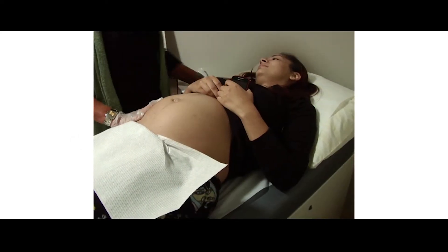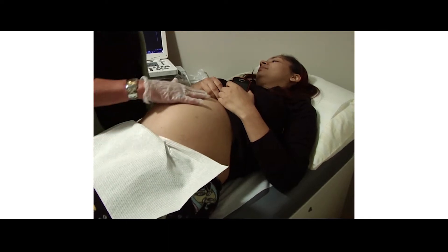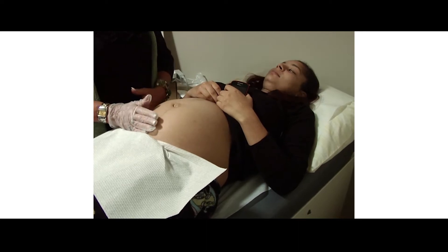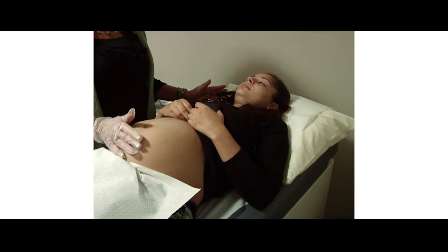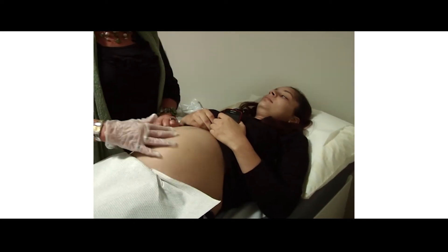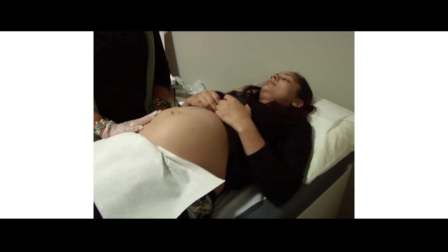I'm going to start off with our sagittal midline. You're going to do a lower and then move up and get an upper, get in the fundus. Then you're going to go transverse and go inferior down for your feet and climb all the way up until you're out of uterus. Then you're going to take a picture of the uterus just in the middle, but you're not concentrating on baby at that time.